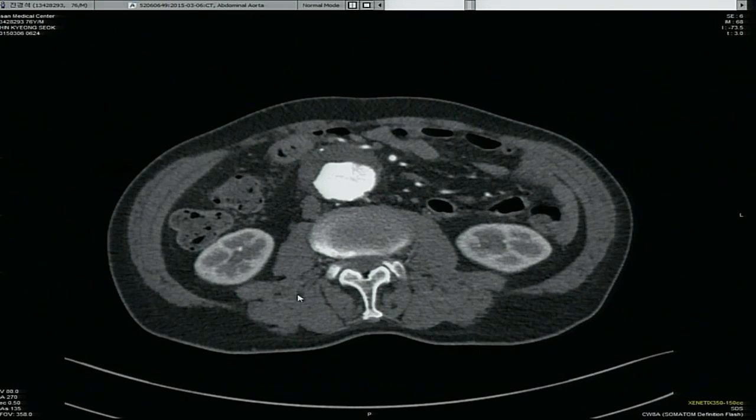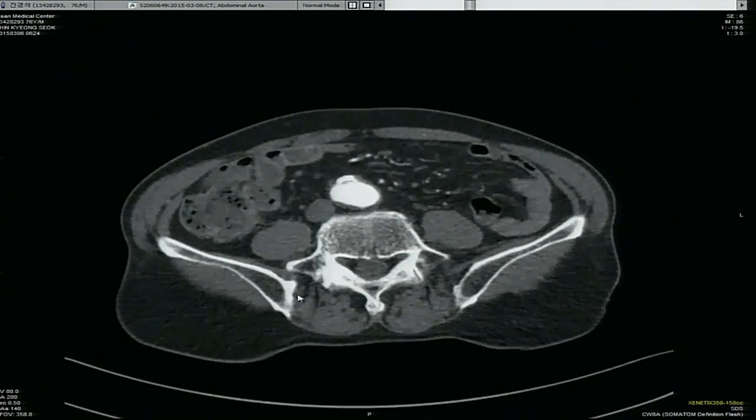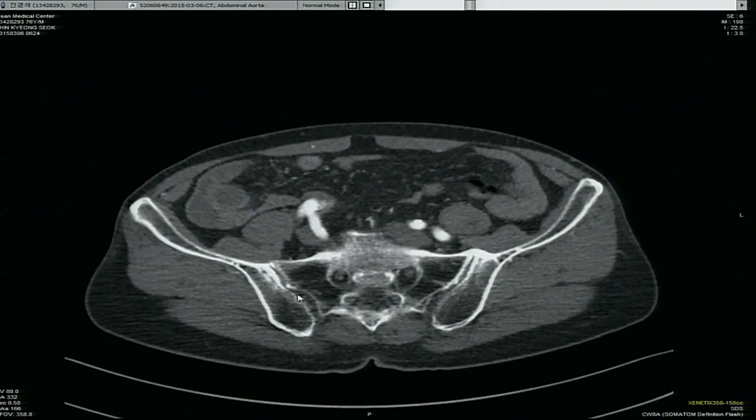That sounds reasonable, Bill. Okay, let's keep going on the CT scan. What did you estimate the length of the infrarenal neck to be? Boy, I'll show it to you on the angiogram in a minute here, Bob. Hold on one second. Go back on the CT scan.